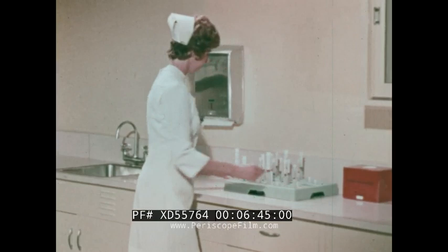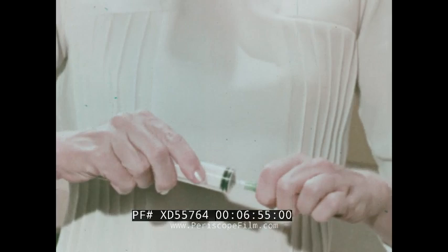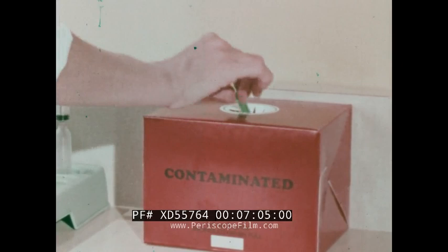Upon completion of the medication round, the contaminated unit should be destroyed. The needle cannula is broken off, dropping into the sheath. The hub is inserted in the sheath. Holding the syringe in one hand, a quick snap of the needle sheath destroys the syringe tip, leaving the needle broken and encapsulated in the sheath. All parts are placed in the contaminated materials box for incineration or disposal.